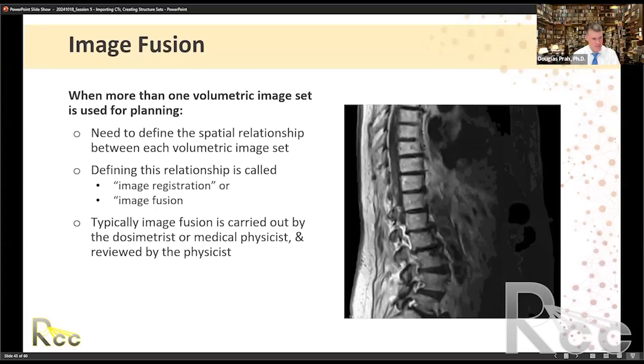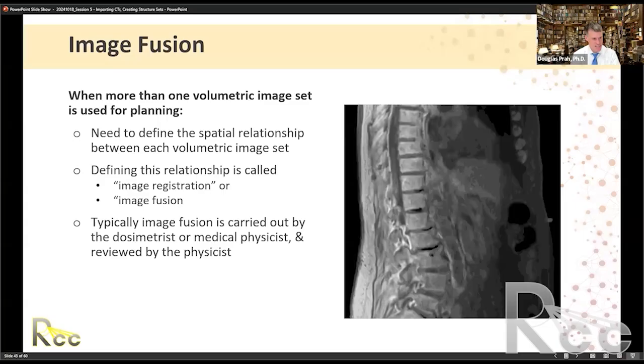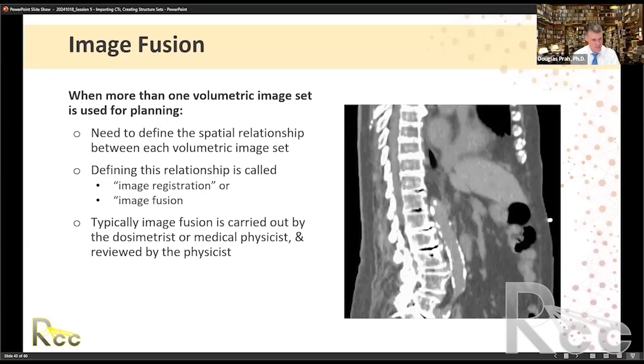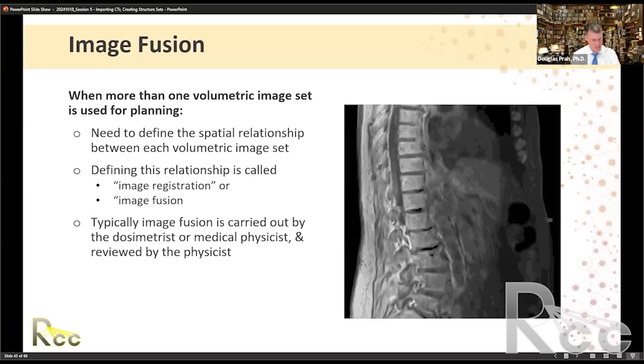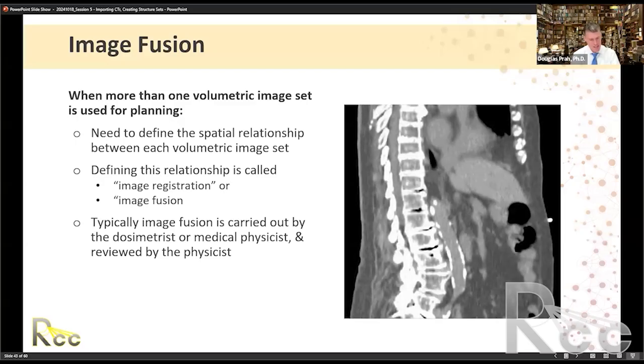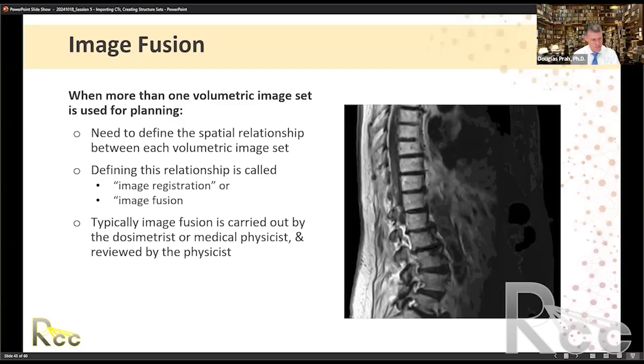And then they call up radiation oncology and ask them, we need this treated. So we usually don't get another scan. So you have to remember that sometimes the scan might not be in the exact same position. In an ideal case, if you can control it, it's great to get the same immobilization device, but in reality, it's not always possible.